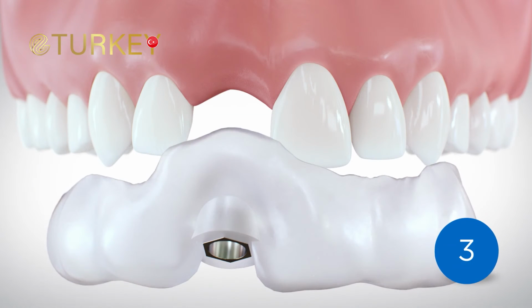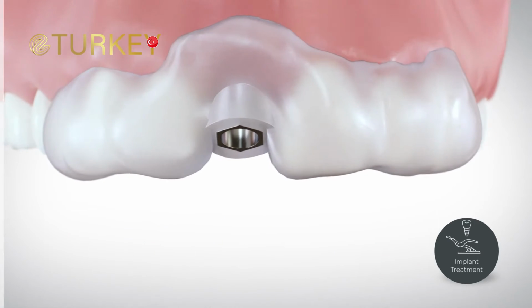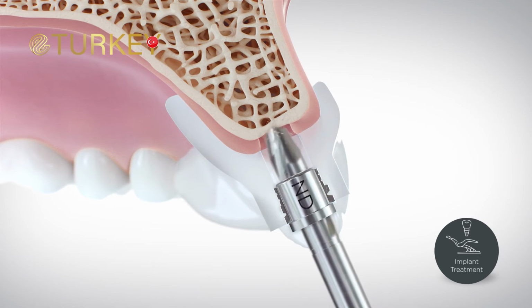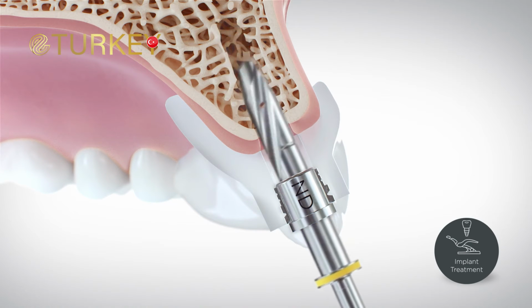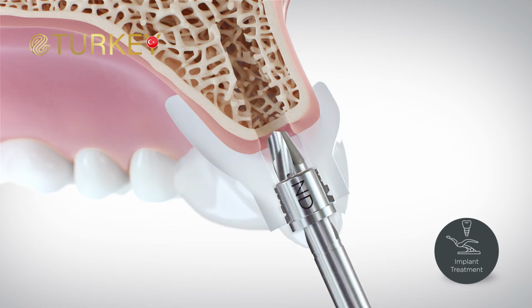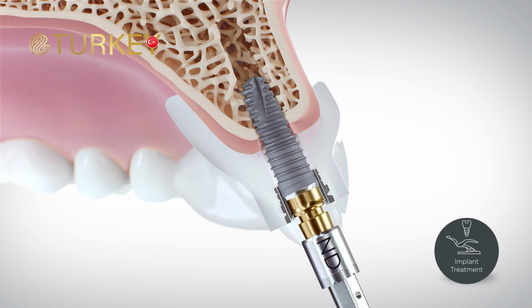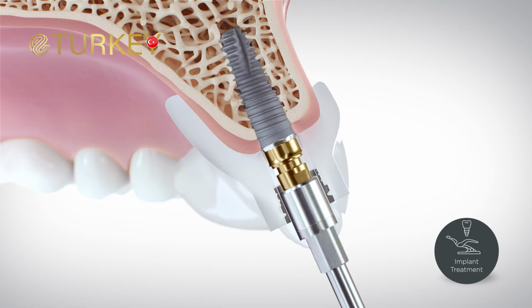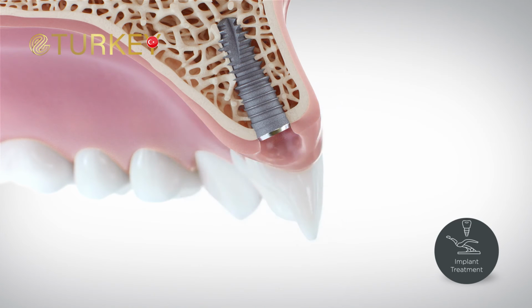During Step 3, the surgical guide is attached to your teeth. The bone is prepared for the implant. And the implant is inserted in position exactly as planned. A temporary abutment and a temporary crown are put in place.